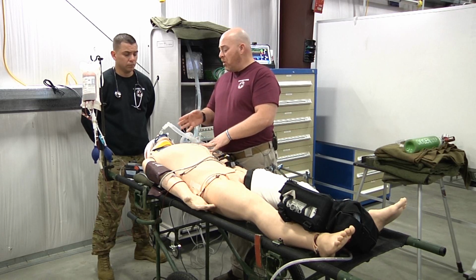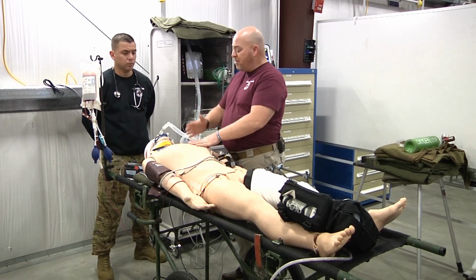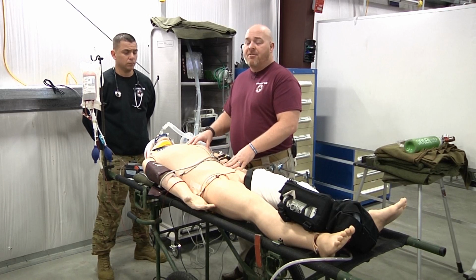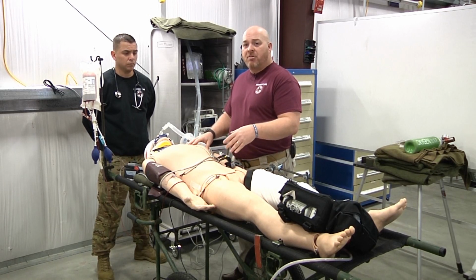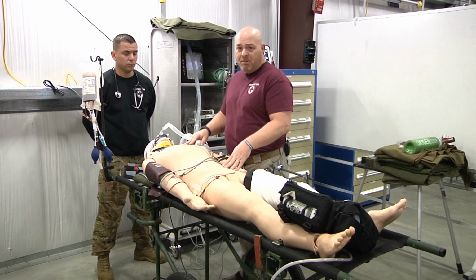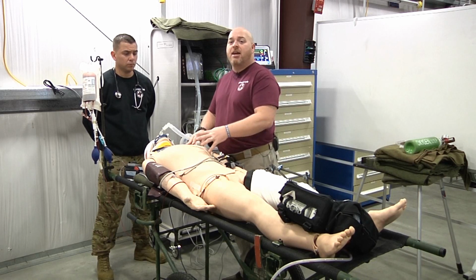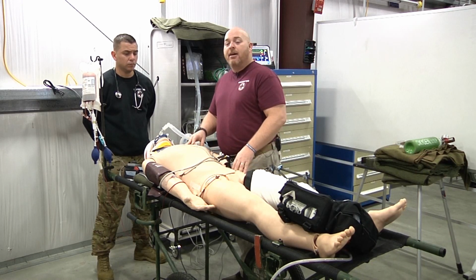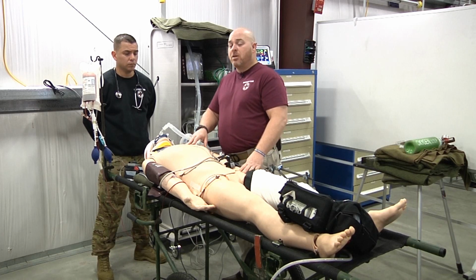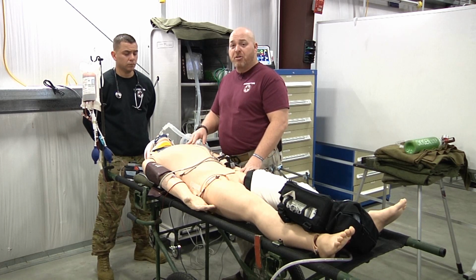All right. We're going to calculate our vent settings. We're going to look at what the hospital has them on. Say this patient is on a tidal volume of 490, respirations of 16, FiO2 at 80%. We're going to make sure that the respirations meet the needs of the patient. If something seems off, if something doesn't feel right, please feel free to talk to your doc and say, hey, why were the vent settings at this or that, before you make any crazy adjustments to your ventilator. Most commonly, the hospital is going to have them on the appropriate vent settings, but it's really good for you to double check.